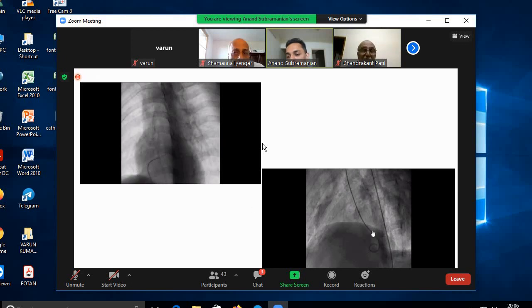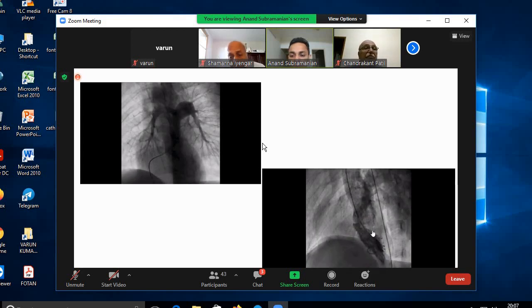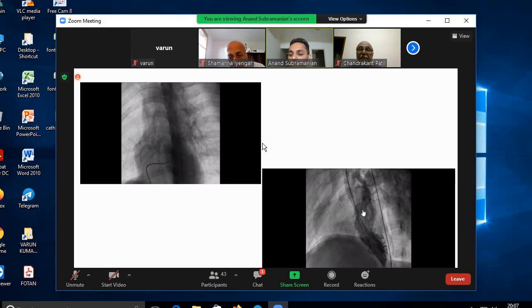So the left ventricular angiogram is done only if you're suspecting some additional VSDs, which might not be seen even on a color flow on echo because the pressures in the LV and the RV are the same. But you might be able to make out small jets when you give a pressure injection. And when you give an LV injection, you also look at the aorta and you can make out the coronaries that they are filling.